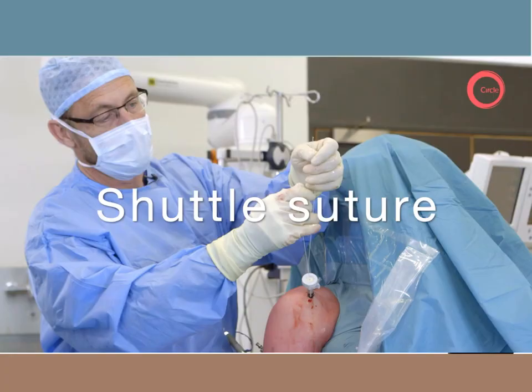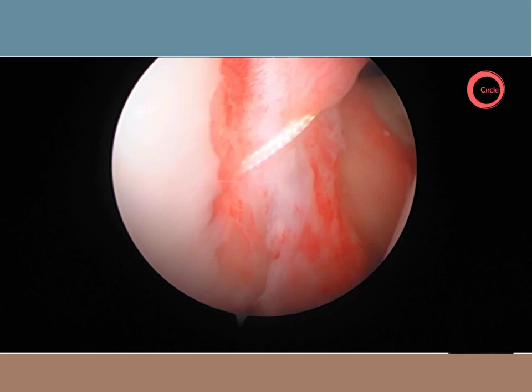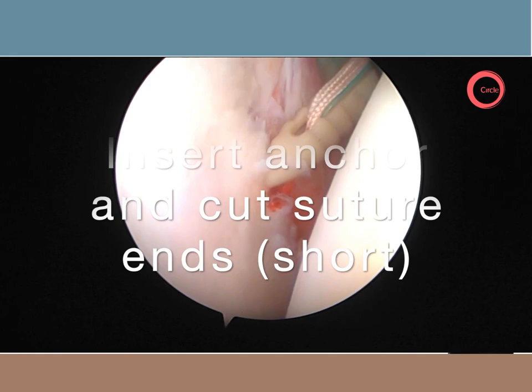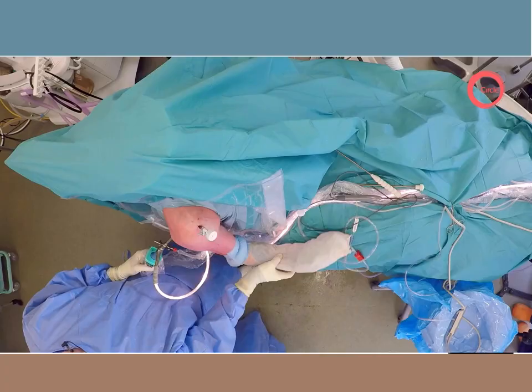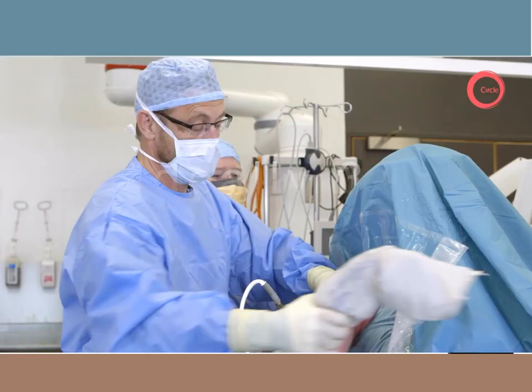If I'm happy with the tension and range, I pass the sutures into the anchor and secure them with a clip or snap. I'm then ready to drill at the appropriate site and immediately insert the anchor, minimising the risk of losing my hole and correct insertion angle. I ensure I cut the suture ends as short as possible, minimising the amount of exposed suture material in the joint. I usually try and insert three anchors, but care must be taken not to over-crowd these to minimise the risk of subsequent glenoid rim fracture. I then check the range of movement and stability at the end of the procedure.